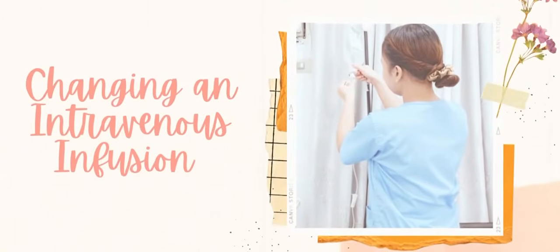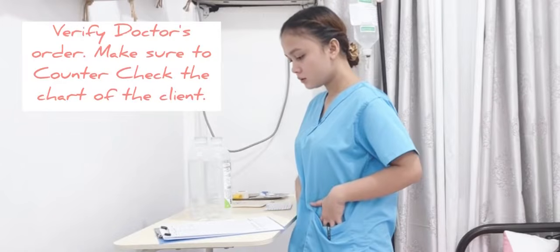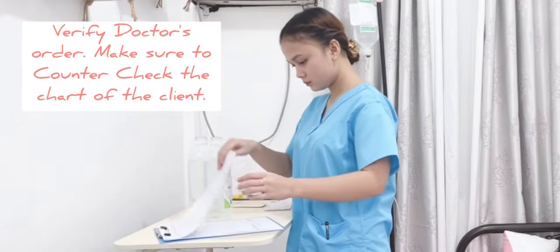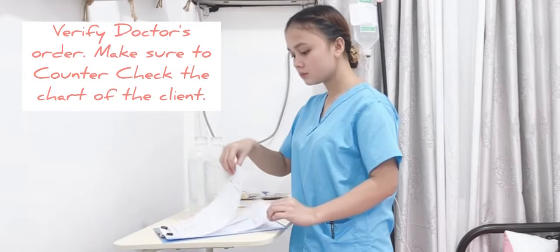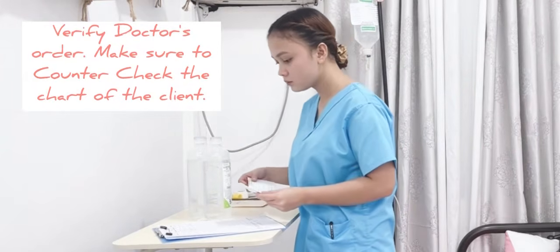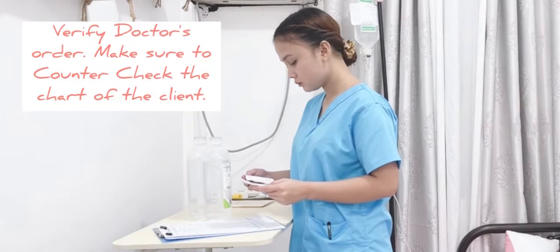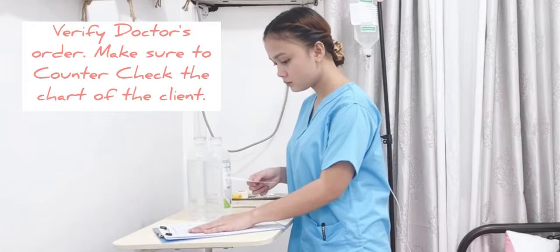Next one is changing an intravenous infusion. First is to verify doctor's order. Counter-check IV label, IV card and bottle number, bottle sequence, type, amount, additives if any, and duration of infusion. It ensures that the correct solution will be used.